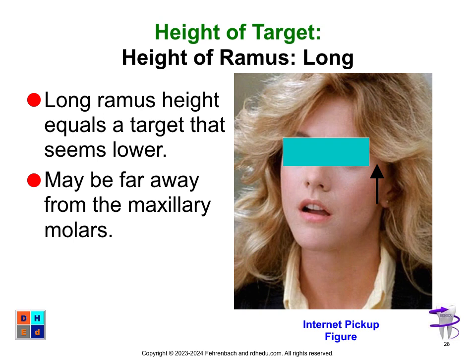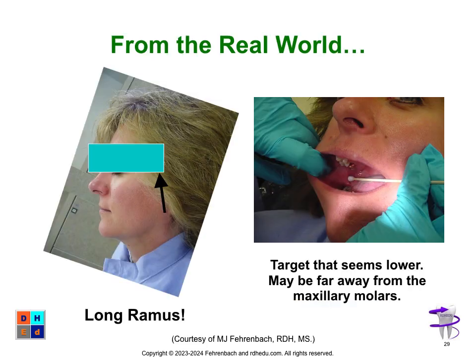And don't think buccal. I know some people are talking about it. It may be an infiltration of the PDL, but a true buccal injection, and we need that because of furcations. I need pain control there, and I certainly need hemostatic control for the buccal of the first, second, and third molars. And people are keeping their thirds now.